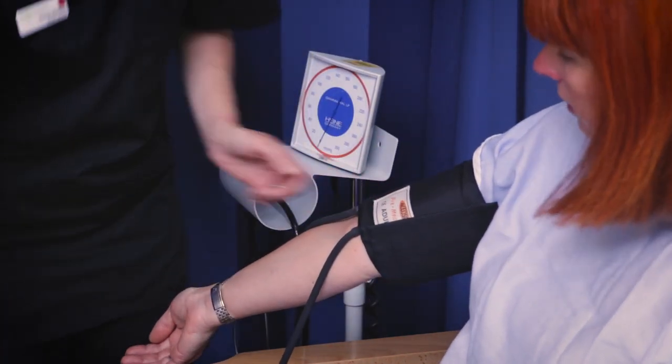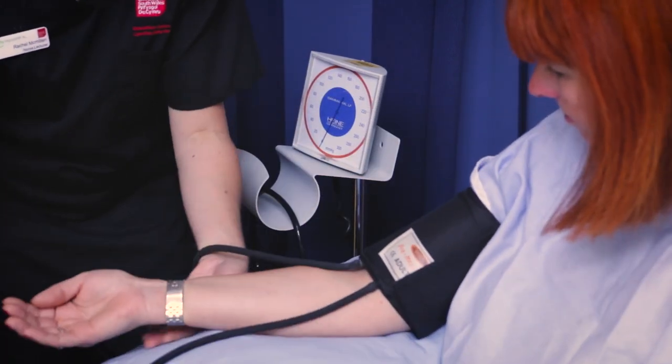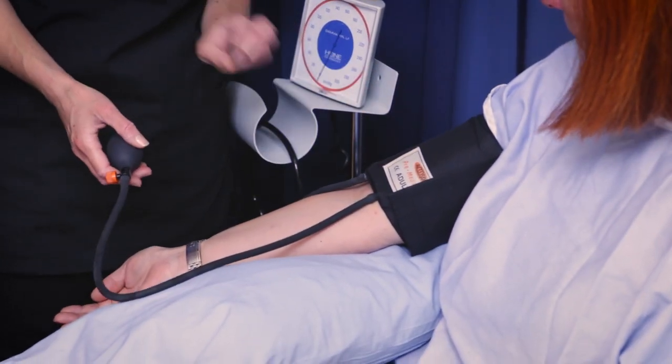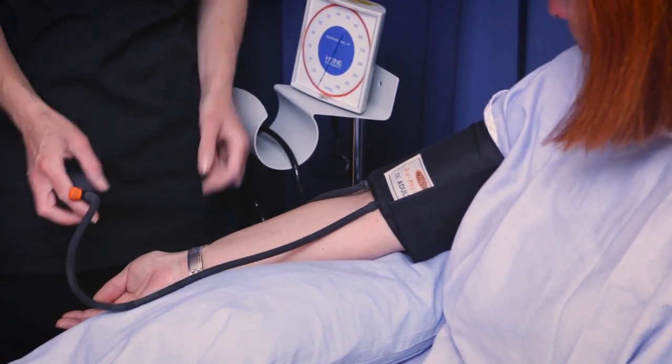You need to make sure there's no tight clothing or anything, because that can obviously affect the measurement. And what I'm going to do as well is get a pillow and support Maria's arm like so. If the arm's either too high or too low, it can really affect the measurement. So it's important that the arm is supported, the patient's relaxed and has been in a relaxed state, because that can affect the reading as well.